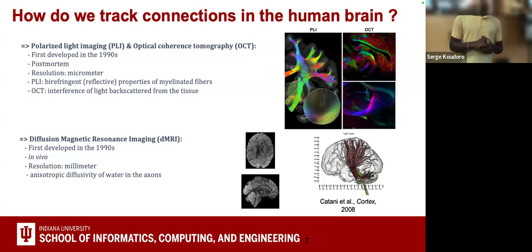But the big advantage of this is it gives you very high quality data. So this kind of technique will help us to understand the different tracks that we have in the brain.